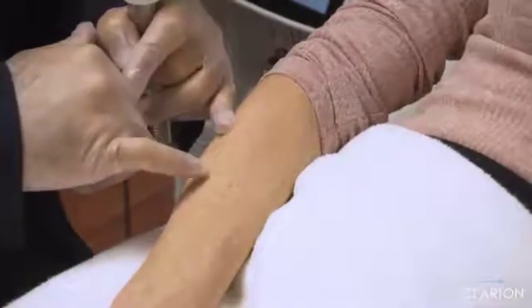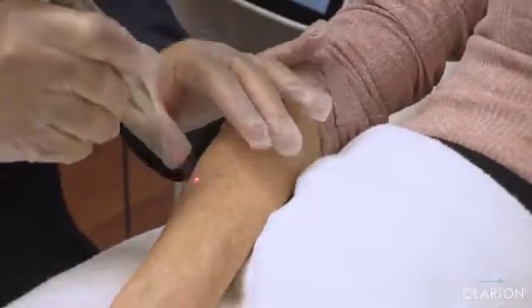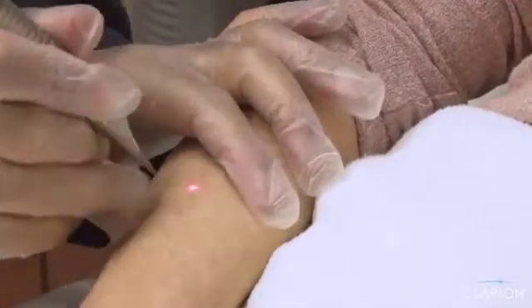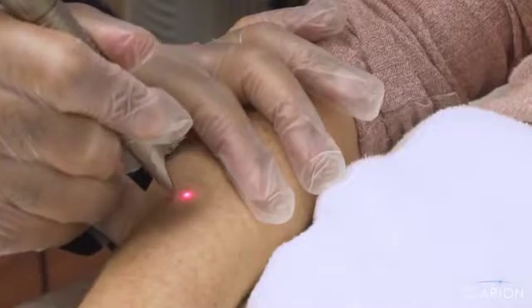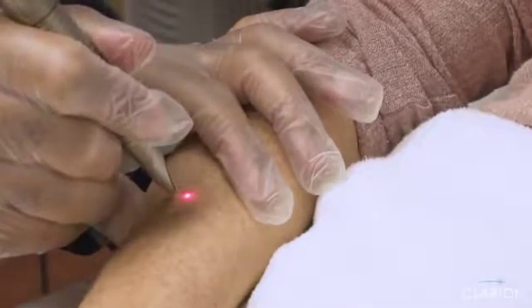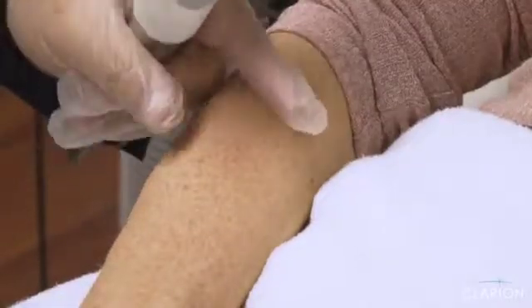I'm going also to remove another spot here so that we can demonstrate that and we can see the effect. So we are going to remove this. And the pigment is almost gone.